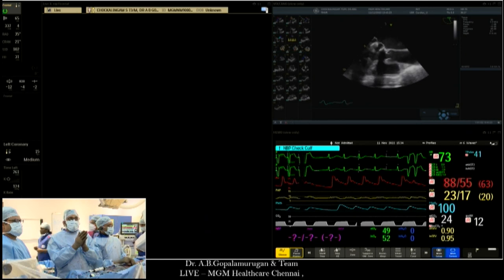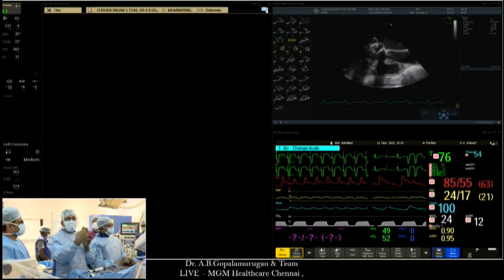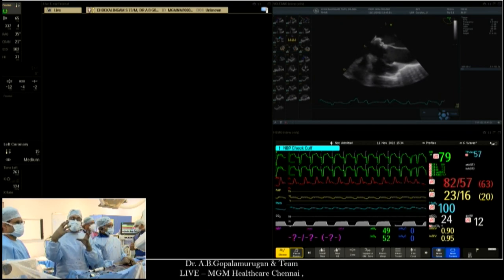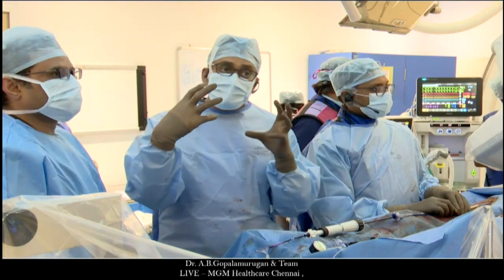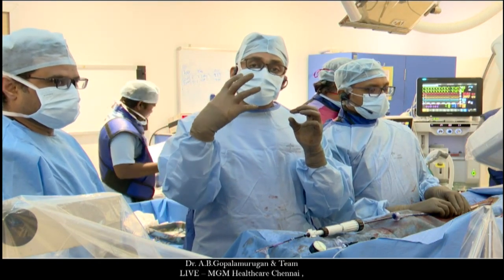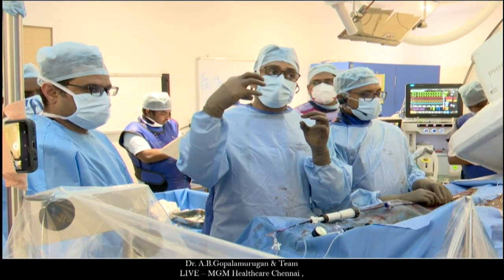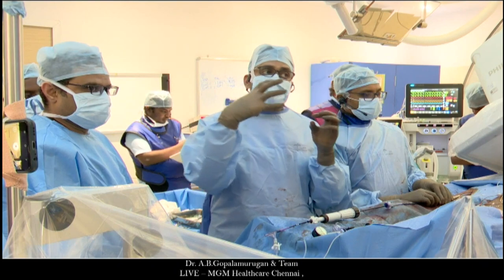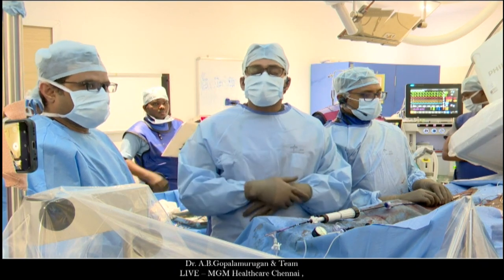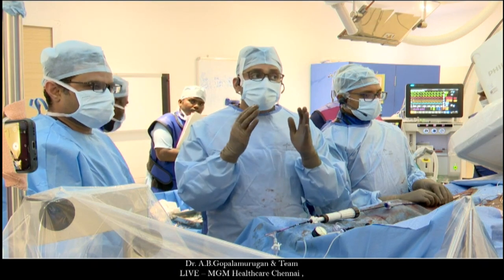Number two, whatever you do, you have to be very slow, because you will have to wait for the atrial and the ventricular portions both to dumbbell. Because if you go quick, what you risk is the ventricular portion alone going high and the atrial portion being a cone. When that happens, you're guaranteed embolization into the ventricle. Of course, I've had that before also, and it's a disaster. So it is important you wait.